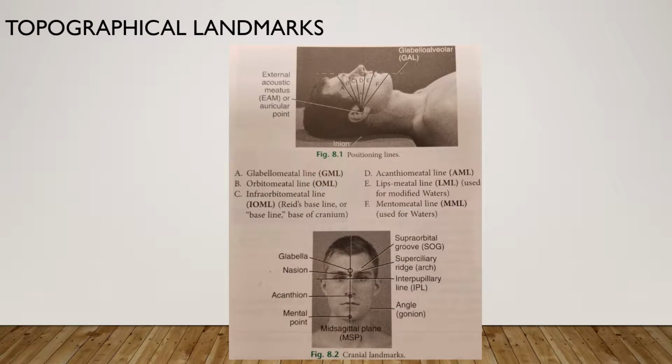Now, this is probably the most important portion of the lecture, the topographical landmarks. These are going to be very important for you when you're positioning the patient. So when I'm talking about these, you may want to touch that part of your face so that you can see where that is located.